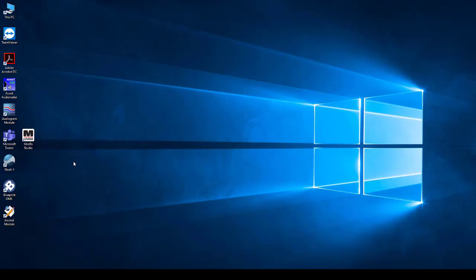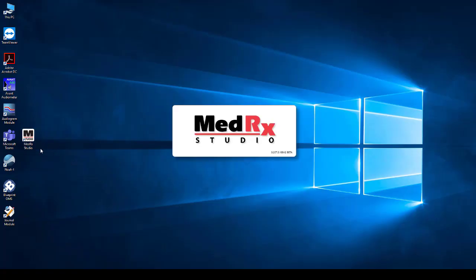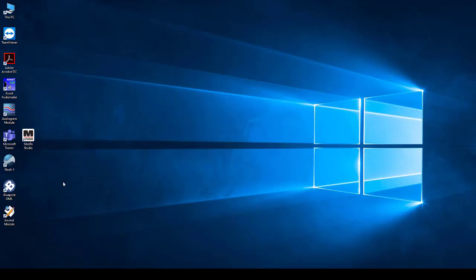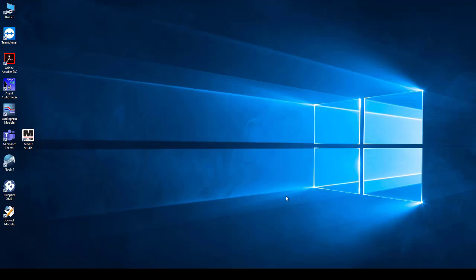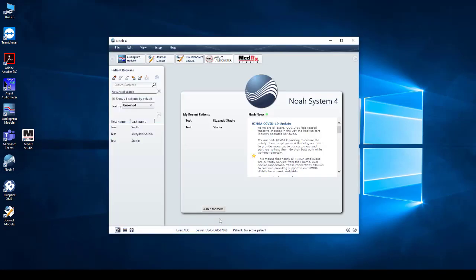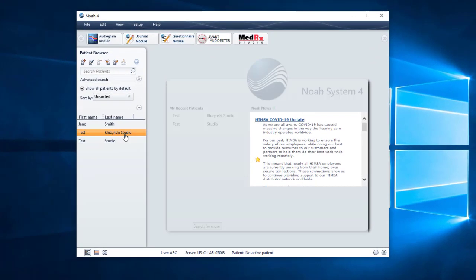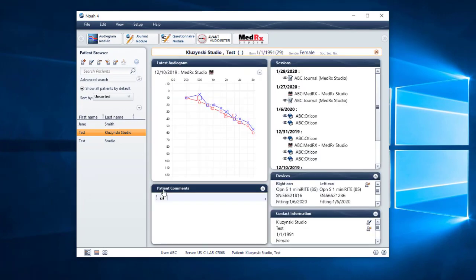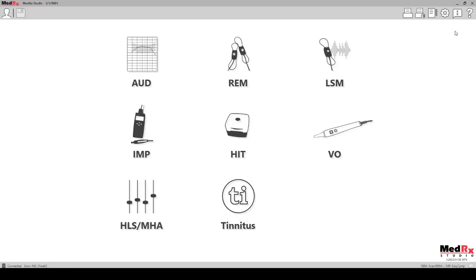To launch the software, click on the MedRx Studio icon from your desktop. To launch within Noah, open Noah and select a patient or add a new patient to begin. Then select the MedRx Studio option from the Noah modules to launch the software.